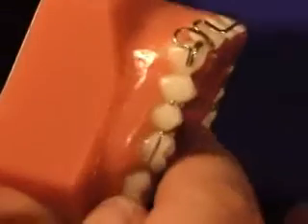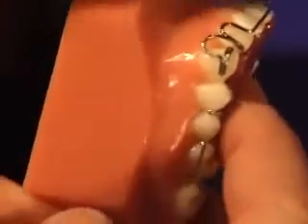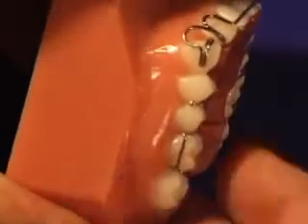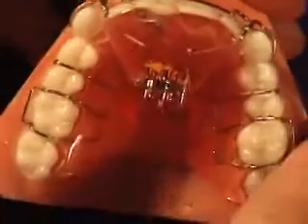One point to show you with removable appliances: quite often patients will turn the screw but will not be wearing the appliance. This is easily seen by you because the appliance simply will no longer fit into the patient's mouth.